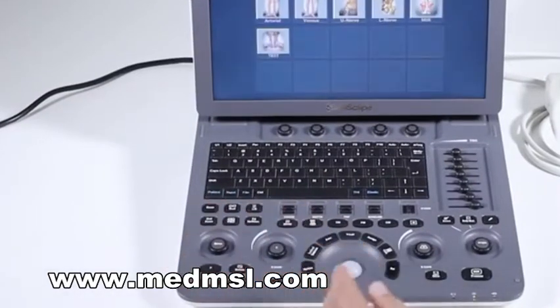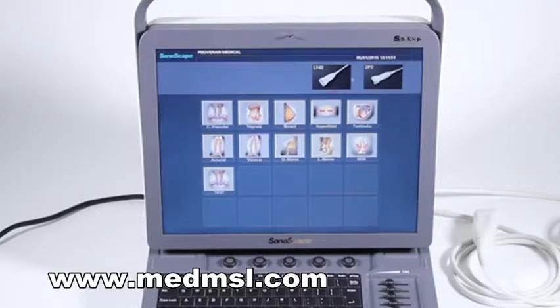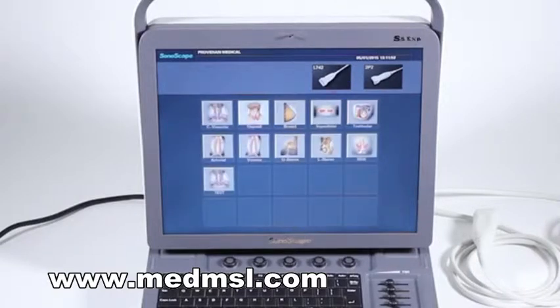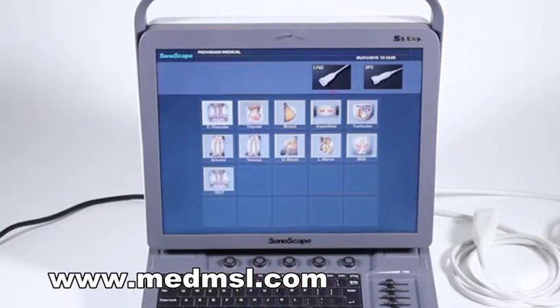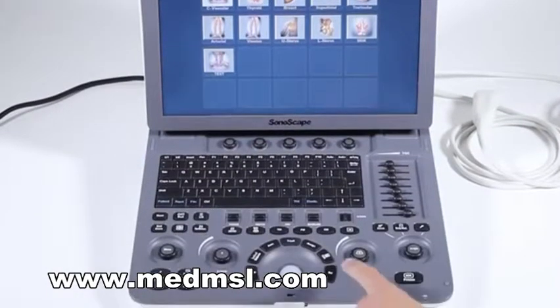To go back to that screen, I'm going to hit exam, and here are all the different presets available for this particular probe. When I switch probes, I have a whole new set of presets and calculations available. Here I'll just select cardiovascular — all these blank spaces are for custom user presets. I have a test preset I created myself, and we'll show you how to set that up in a later video. So let's go ahead and start with cardiovascular and take a look at the system.